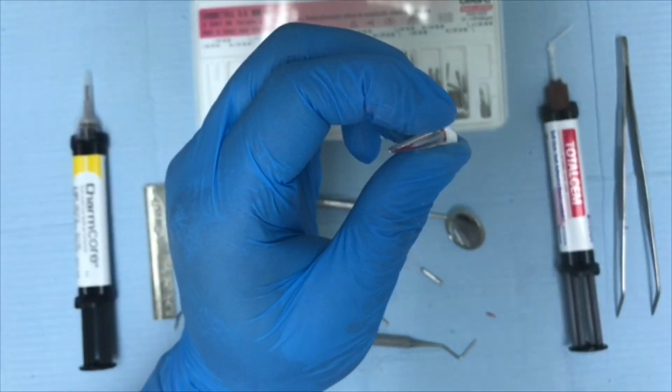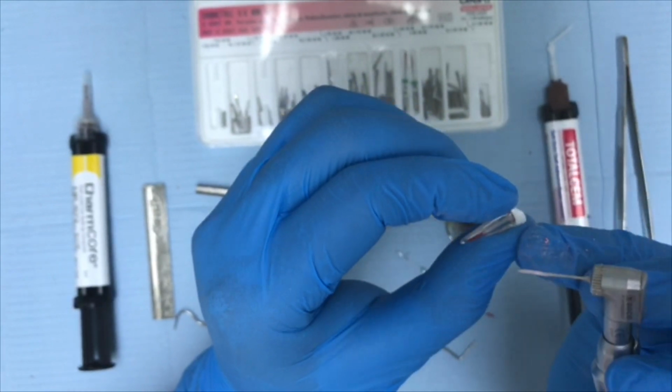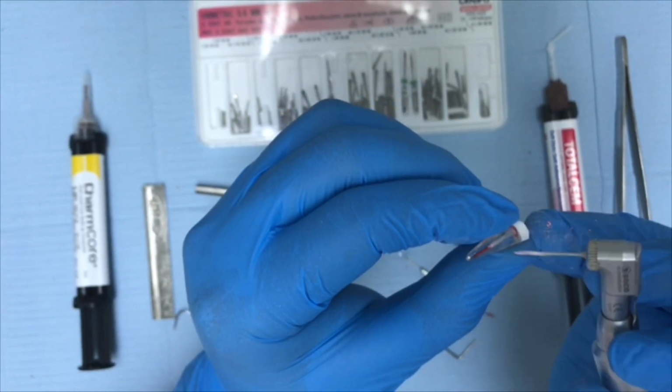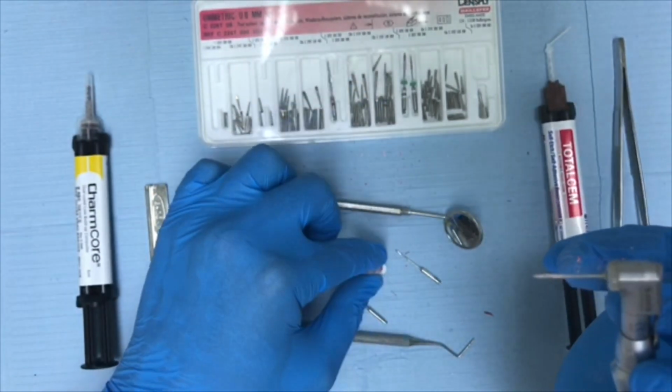Okay, once the gutta percha is completely removed from the root canal, and you have to make sure that there are no remnants of gutta percha inside it, you can now shift to the drill.